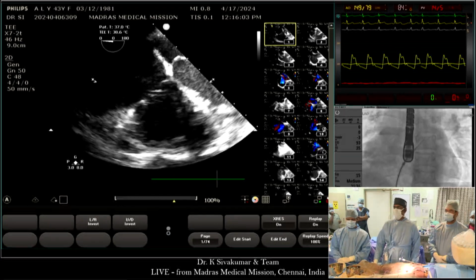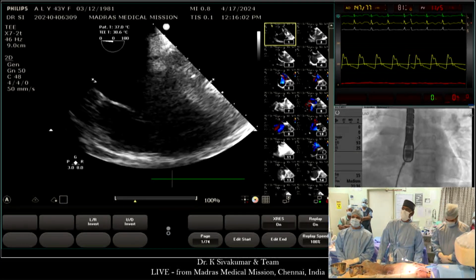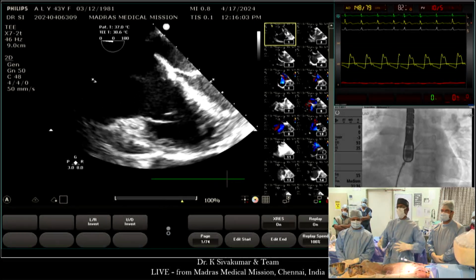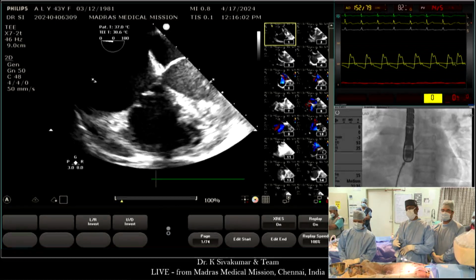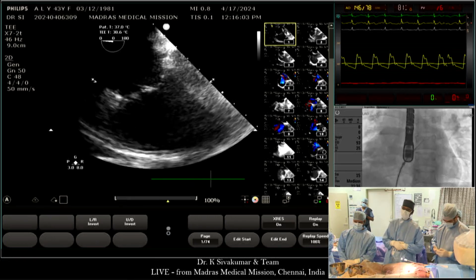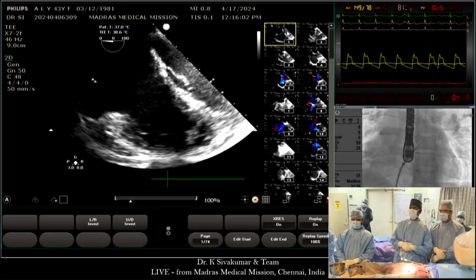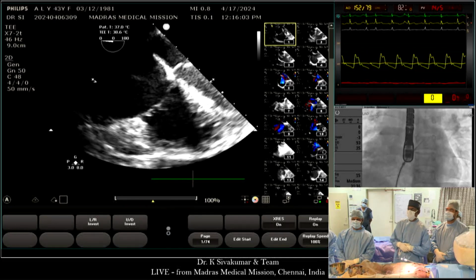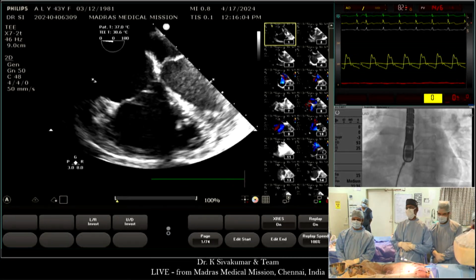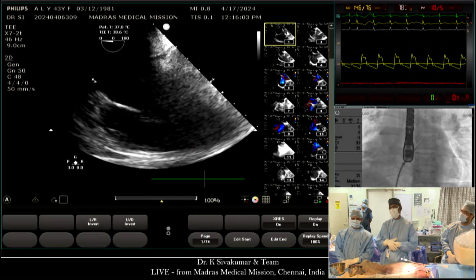Sivakumar, back to you. I heard all the opinions. Of course, we respect a lot the opinion of senior surgeons like Dr. Zuhair Halis. And I would thank the senior surgeons for coming to these meetings, and it's extremely good to have surgical participation. We had a surgical discussion. This right upper pulmonary vein is at a distance of 3.5 centimeters superior to the cavo-atrial junction, so the surgeon felt that in a 43-year-old lady, he would prefer to leave it to drain into the right superior vena cava. The vein was measuring about 9 millimeters in diameter.